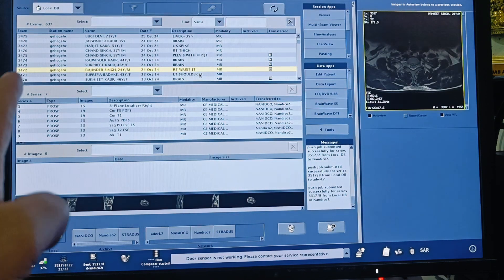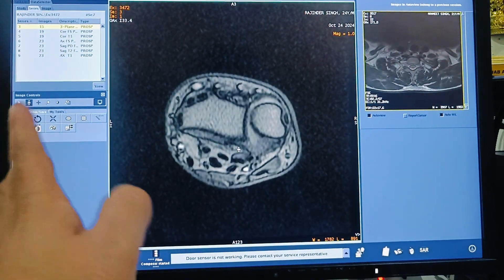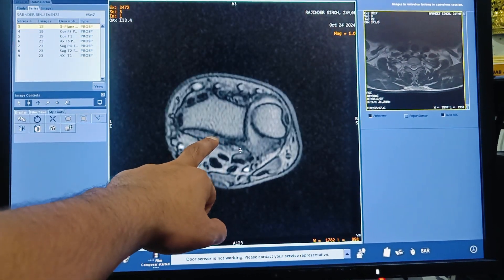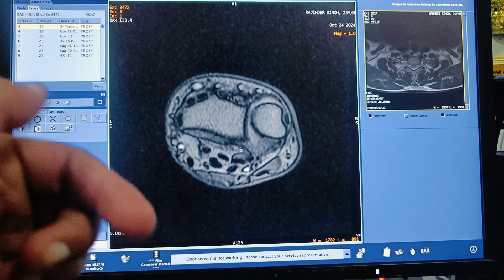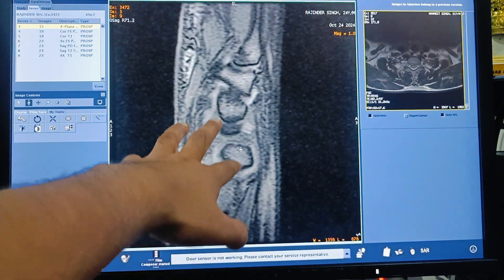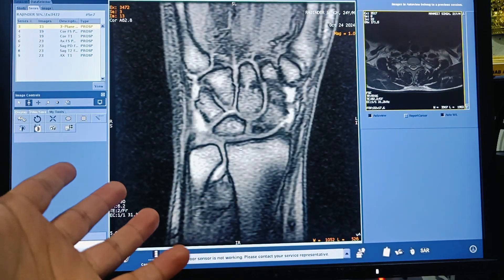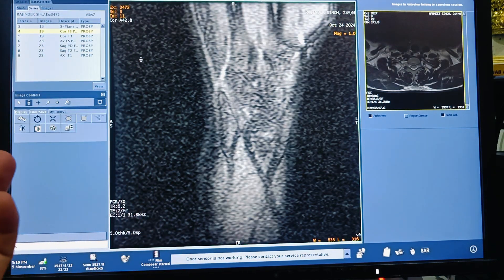Now I want to share the protocols on the MRI console system. A three-plane localizer is acquired first, which includes coronal, sagittal, and axial sections. This localizer is usually completed in less than 25 seconds and looks like a T1 low-resolution scan. After the localizer, the main planning includes coronal PD, axial, and sagittal sections.